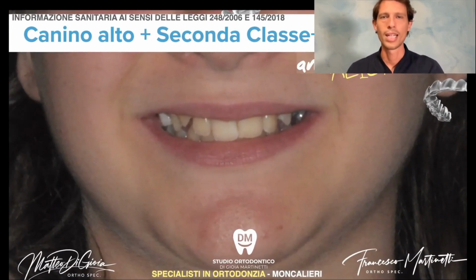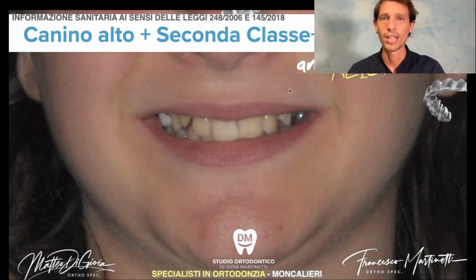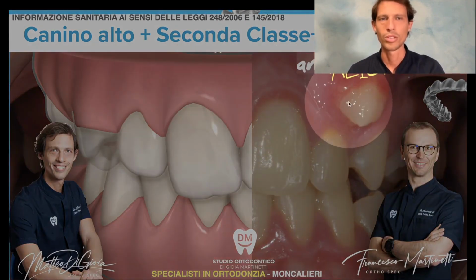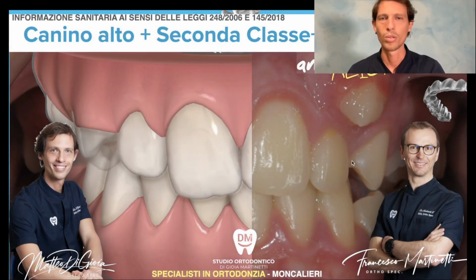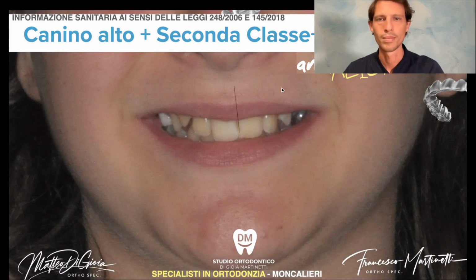This is the initial state of her smile. As you can see, there's the mouth. All the teeth are shifted to the left, where on the left side the high position tooth is present. And with this tooth, there's no space at all. One of the reasons is that the front teeth have all tilted to the left, taking up the space needed for the canine to erupt. Look at the degree of inclination.